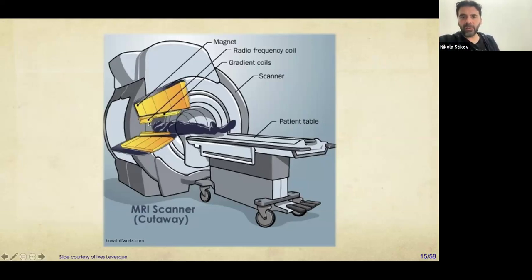And finally, there's another coil called the radio frequency coil. And that one is an electromagnetic field that's usually applied for very brief spurts of time. The strength of those fields is on the order of Gauss. And those are really not expensive. Those are really antennas that have to go in and excite the body.